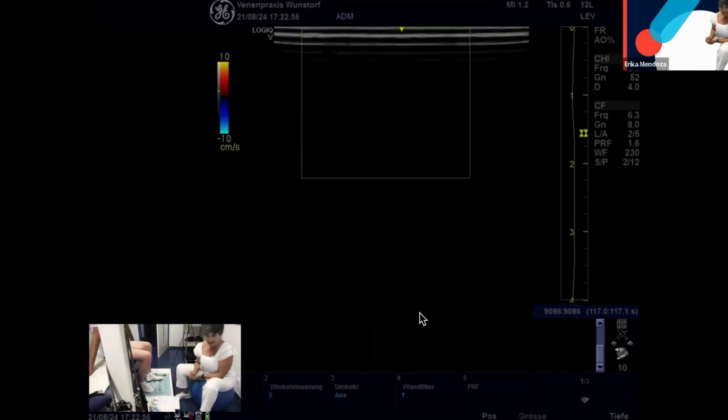So now I want to paint here. Do you see this painting here? I think you have to go nearer. So like this, yes.